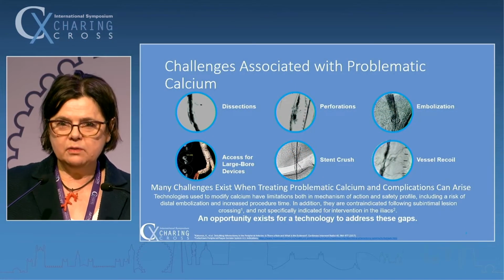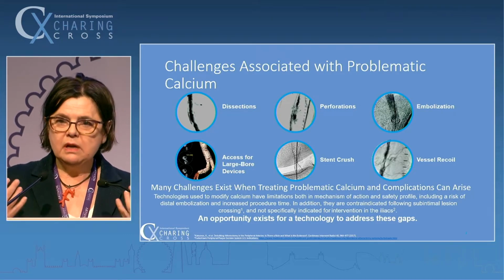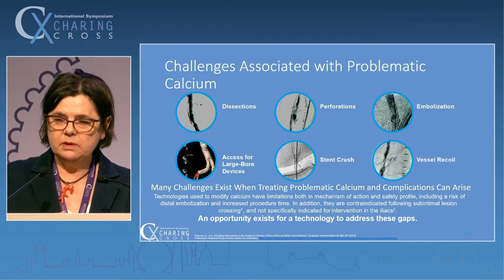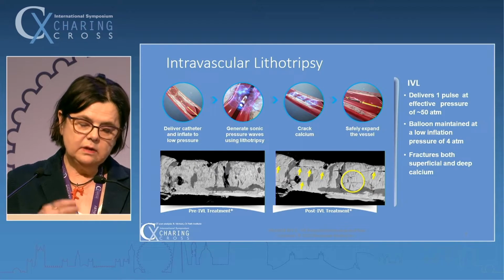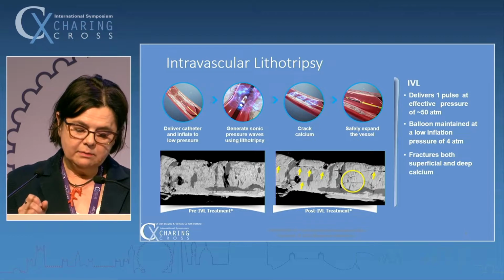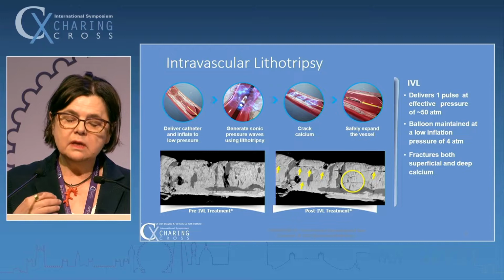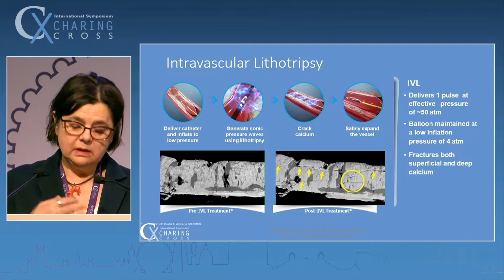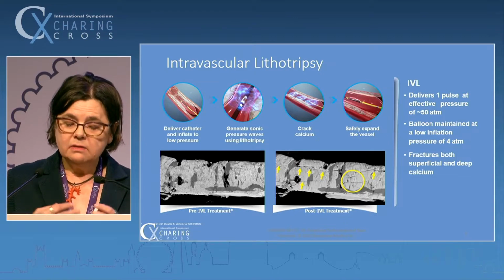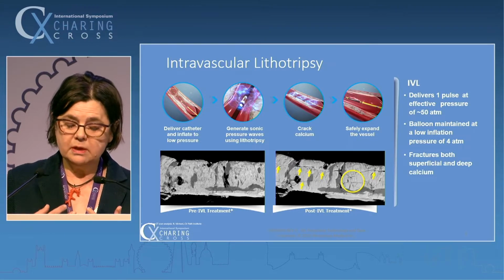We have to deal with calcium in different parts of our body, and this is really a difficult issue, and we are limited with what we have in our hands so far to treat calcium in an efficient way. You see here CT images from calcified vessel areas pre-IVL and post-IVL treatment, and you see the cracks in the calcium. What was really amazing for me when I first used this technology was seeing that the vessel compliance is really increasing and that there is no distal embolization, which I could not imagine before.